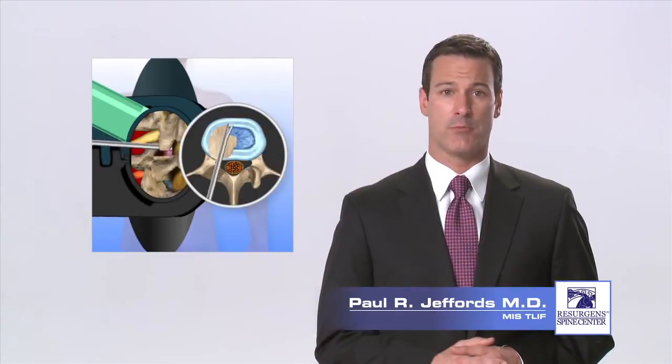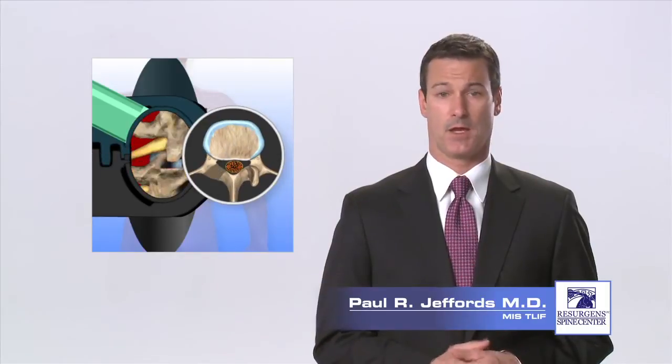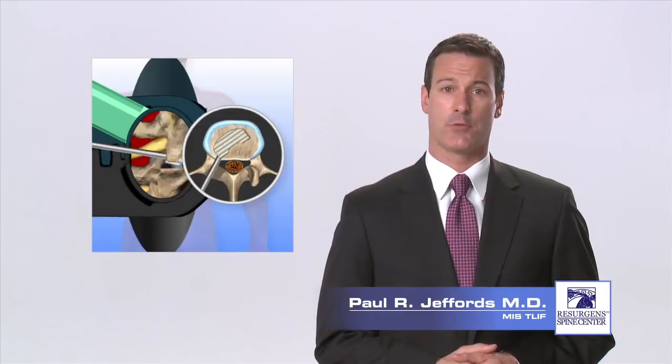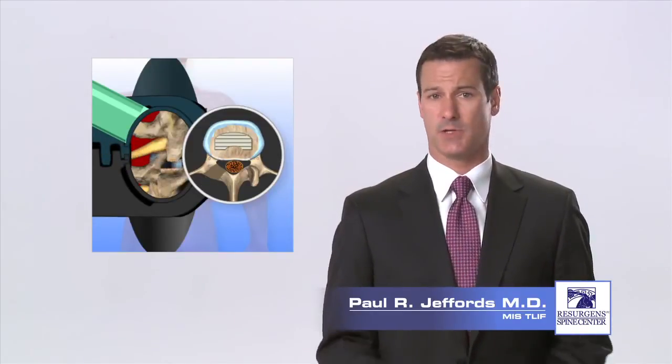Special instruments are then used to remove the majority of the disc, creating a space between the vertebra. A bone graft or fusion cage filled with bone graft material is then placed into the disc space through the retractor, restoring the natural height of the disc space and providing stability as it fuses.